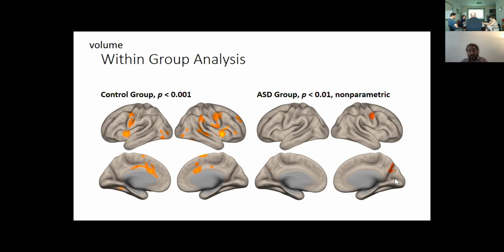But if you do the centering within each single group, when you're looking at the speech minus baseline activation, correcting for motion, but with motion centered separately at the average level of motion within this group, then the effects are not being extrapolated, because you are looking at the 0 level of motion, which is right at the center of that particular group that you are evaluating. So there is no extrapolation, and those results should look much more reasonable.